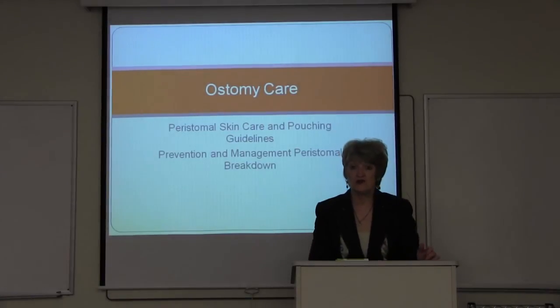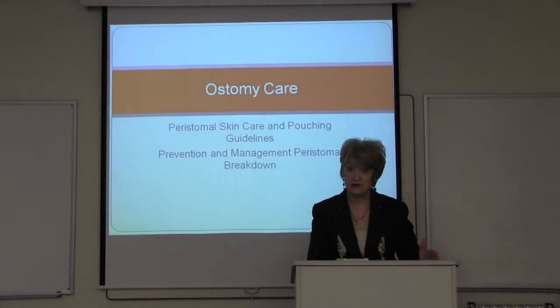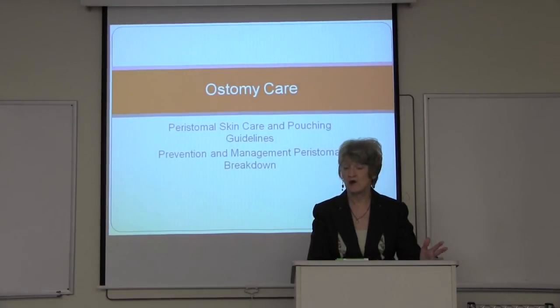In this session, we're going to review the basic principles underlying pouching and peristomal skincare. And we're also going to talk about common types of peristomal skin breakdown, causative factors, clinical presentation, and guidelines for management. Now, in talking about peristomal skincare, a lot of it goes back to matching the pouch to the patient's abdominal contours, selecting appropriate products for skin protection.